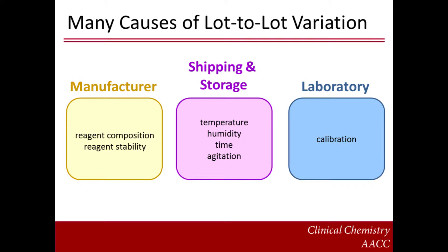The causes of lot-to-lot variation can be divided into those associated with the manufacturing process, those that are due to inappropriate transport and storage of the reagent, and those that occur as a result of laboratory error. For example, a manufacturer may change the process that it uses to produce a particular reagent antibody, and this may inadvertently cause slight alterations in the composition or stability of the reagent.